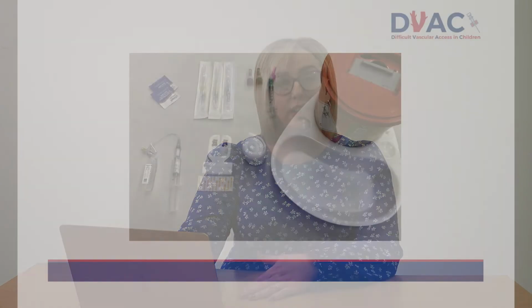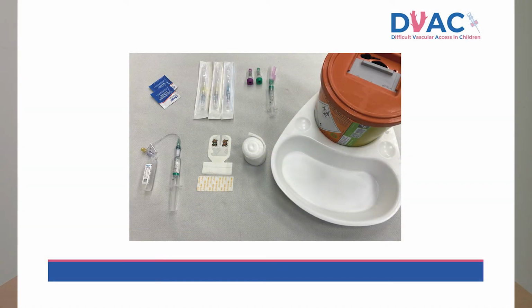Everyone will set things up differently, but essentially you will need something to clean the skin, a selection of cannula, and this is where the debate of winged versus unwinged comes in. It's all down to personal preference. Your blood bottles, a syringe with a needle attached to aspirate your blood samples from the hub, extension tubing that has been pre-flushed with saline and a pre-filled syringe attached, steri strips, dressing and a bandage to secure, and of course a sharps bin to dispose of your unwanted sharps.